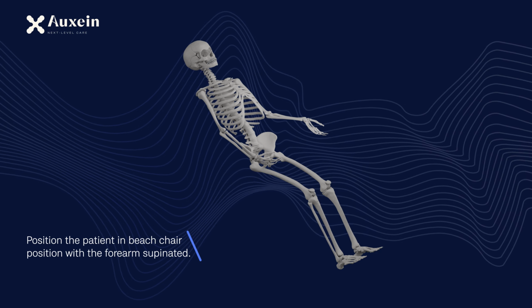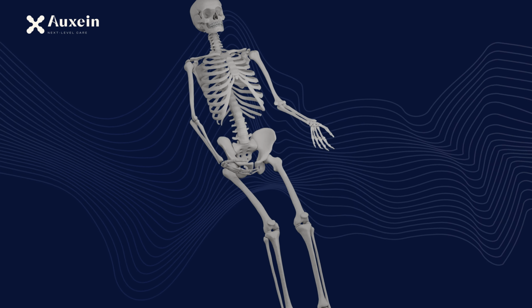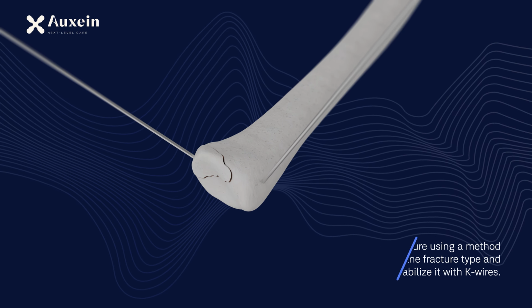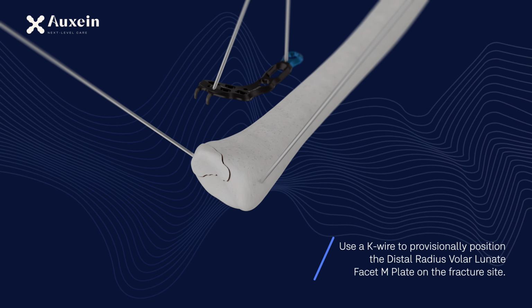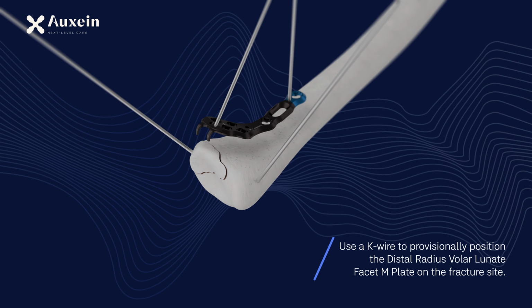Position the patient in beach chair position with the forearm supinated. Reduce the fracture using a method appropriate for the fracture type and temporarily stabilize it with K-wires. Use a K-wire to provisionally position the distal radius Volar Lunate Facet M plate on the fracture site.